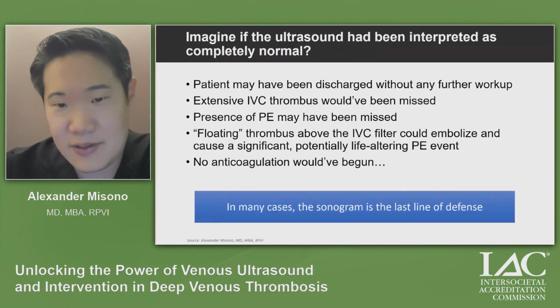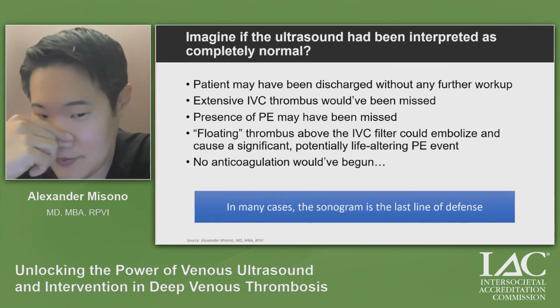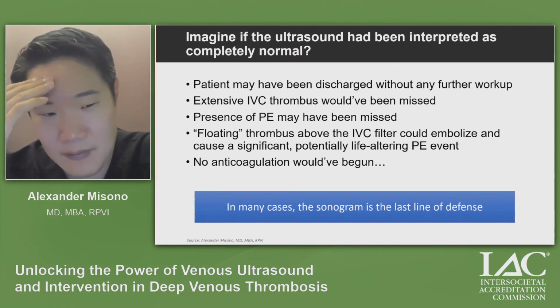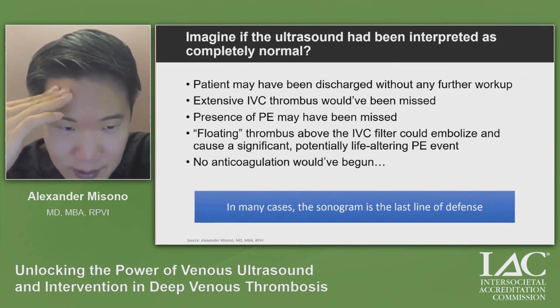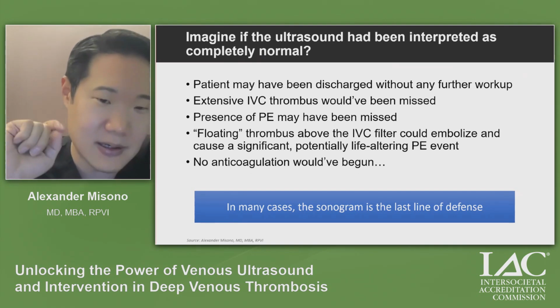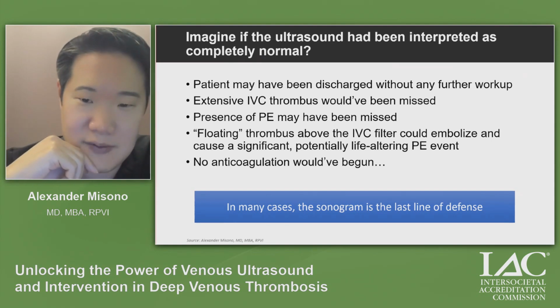So imagine if this ultrasound was interpreted as completely normal. It's kind of scary to think. And I don't want to scare you with this case because this is very, very rare, but it's trying to drive home the point that we really should be taking every bit of data that we have and using it to our advantage.